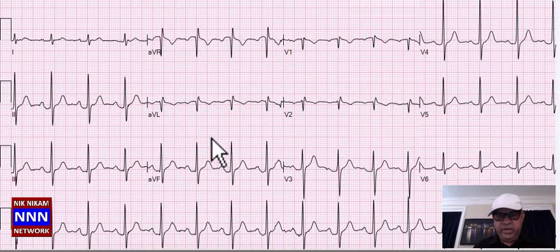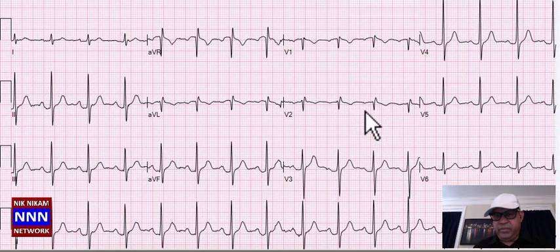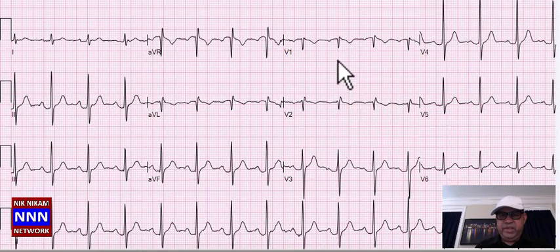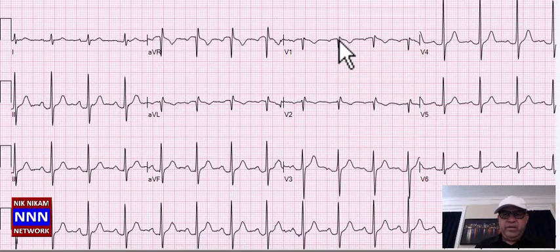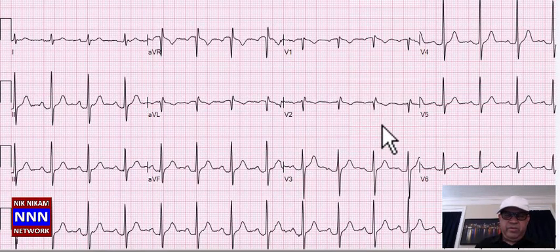This is sinus rhythm. The inferior region looks okay, the anterior region also looks okay. There is an RSR prime, but depending on the age — this patient is 45 — I would call this just a normal variation. Nothing spectacular here.